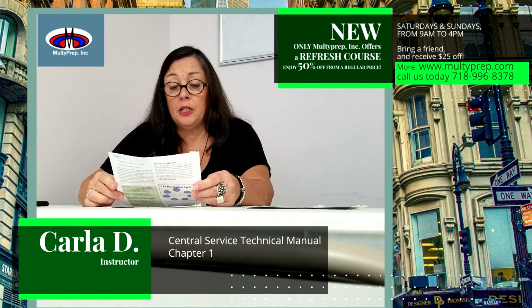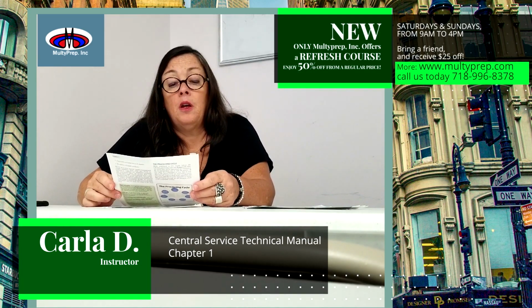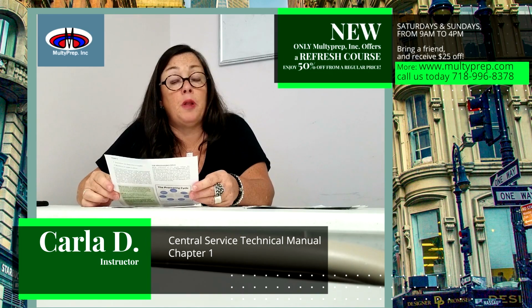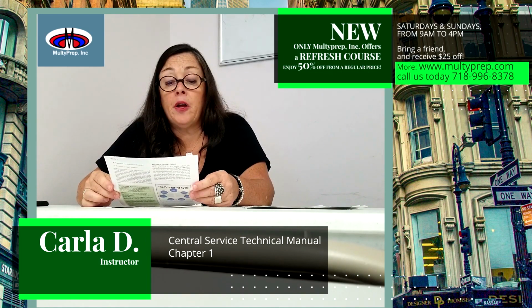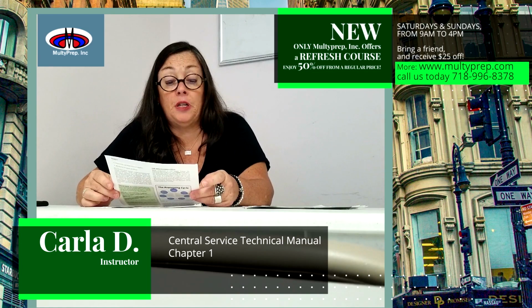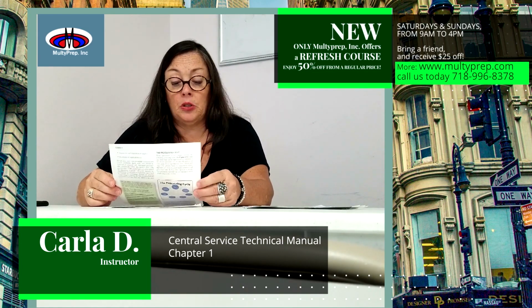Sterile storage and distribution. The supply area of central service is dedicated to the storage of sterile instruments and clean or sterile supplies. A separate area for removing supplies from shipping cartons and containers should be provided. The major portion of the work in this area involves receiving, storing, and dispensing supplies and sterile instruments.